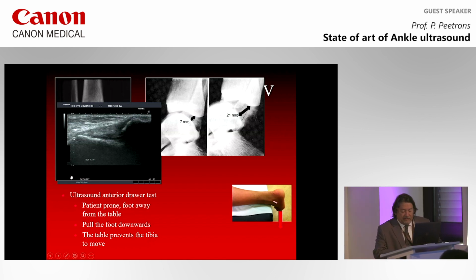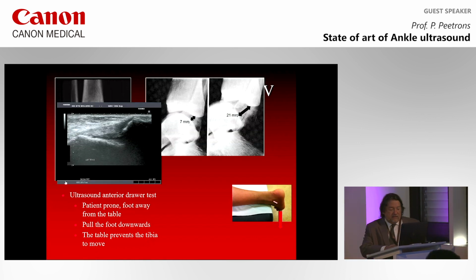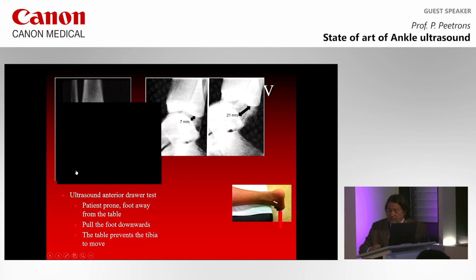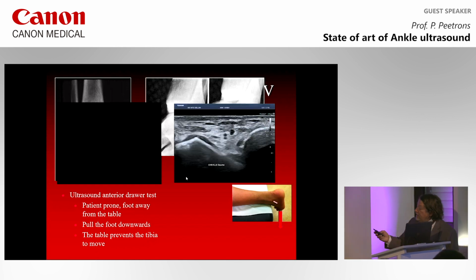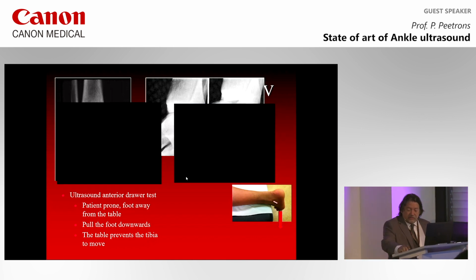This is an example of a normal ATFL. You can see that when we pull the foot downwards, it is in tension, it is stretching, but there are no movements between the fibula and the talus. On the opposite, in this image, for example, you can see that there is a very big movement between the talus and the fibula, because there is no ATFL between both bones. So I will show you how to do it now.